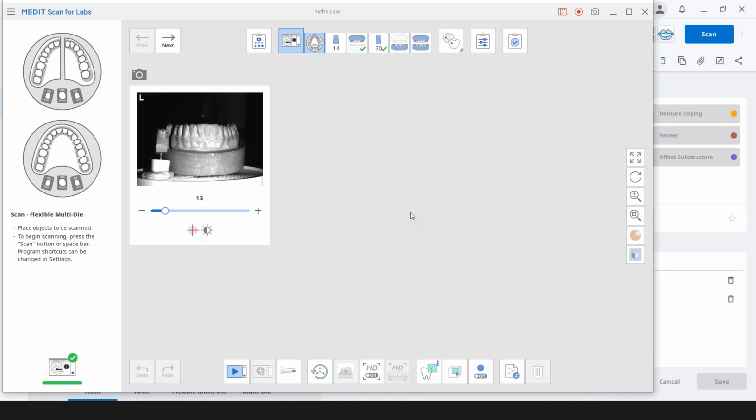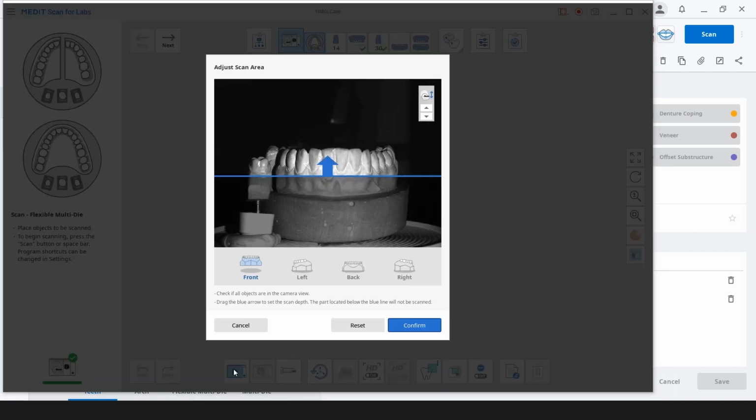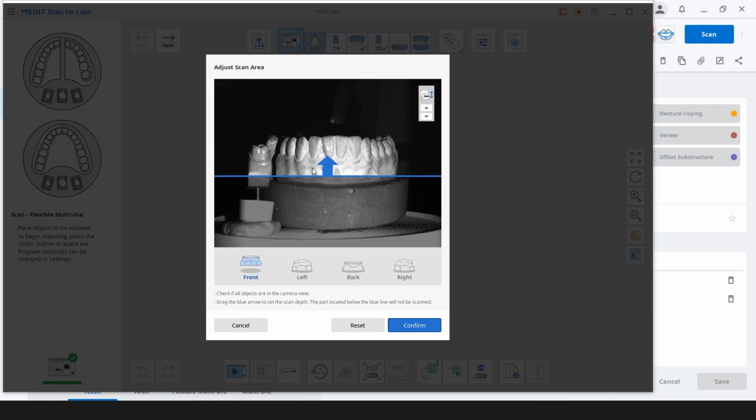All right, so I'm staying within the same icon. I haven't hit next. I haven't moved forward yet. I haven't gone through the path yet. All right, so I'm going to hit scan. So I'm touching that margin because I moved these up and down like that. That's why it's touching, but normally I wouldn't have moved those. It would be right in this standard position here. I don't really have to look through these because I know my model's mounted flat.